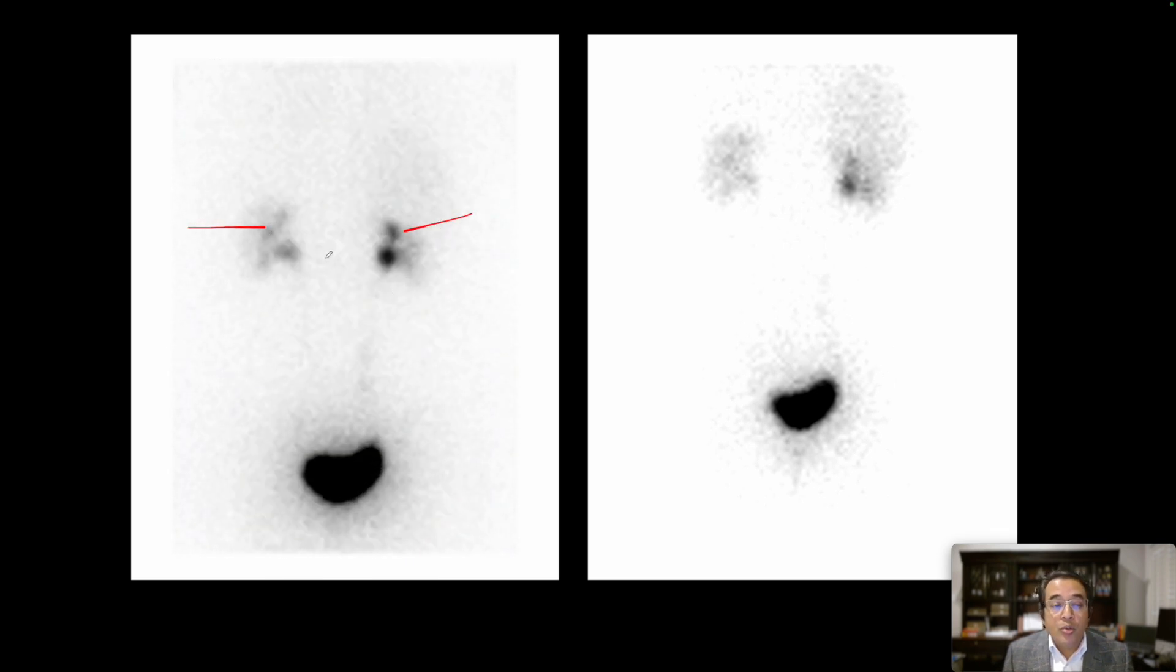And then the nephrographic images, one minute per frame in the posterior projection, showing good excretion of the tracer from both kidneys into the urinary bladder.